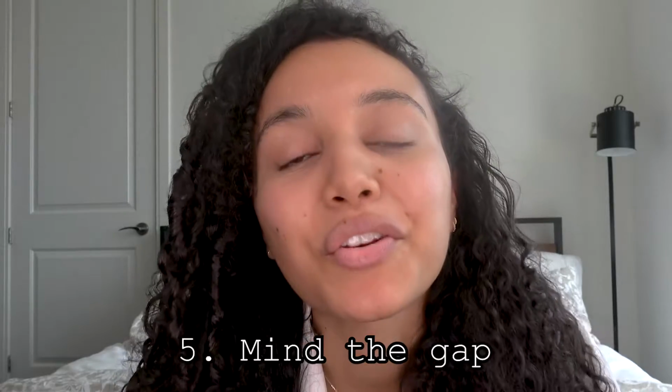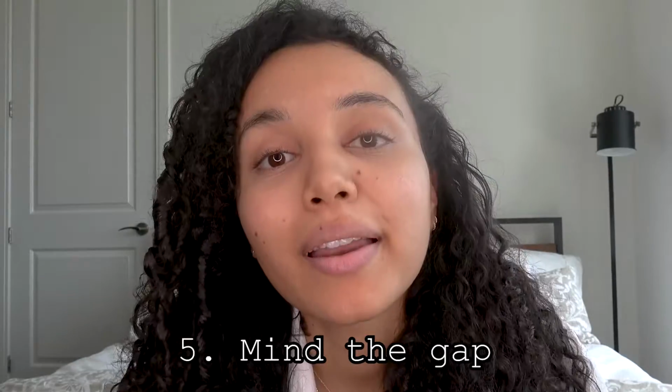Be gentle when you're flossing. I don't know about you guys, but I have some pretty big gaps opening up on the sides of my teeth because my teeth are trying to make room to put this guy back in his place. Sorry, not back in his place, but in his new home. And because of these gaps, food gets stuck in there so easily. And when you're flossing a gap, it's so easy to hurt your gums because there's this big gap. It's not like tight. And it's not like one little point. It's like this. And you're like stabbing your gums, making things bleed. At least I've been there. So be gentle when you're flossing.